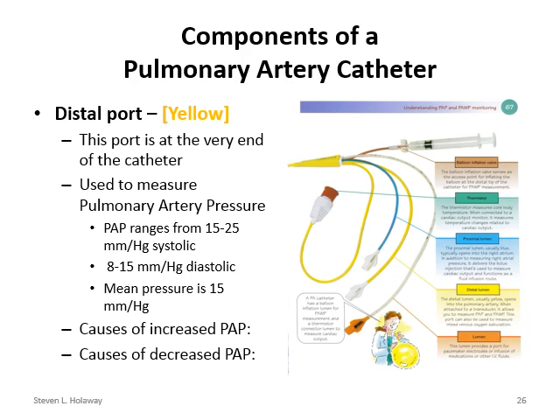Now, a decrease in the pulmonary artery pressure typically is related to volume deficit. Again, it's some type of reduction of the circulating blood volume. And really, that's what we're looking at if we see a decrease. Again, nurses and physicians are using these to monitor all that's going on with our patients.